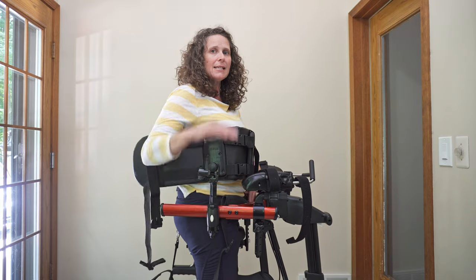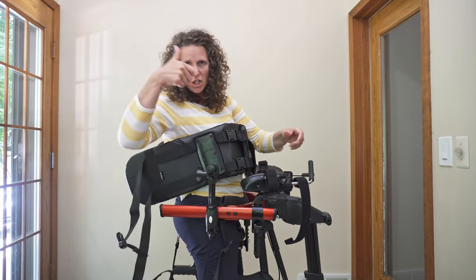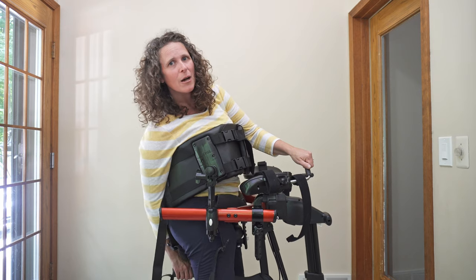Right now my seat is flat, but you can also push the button that is kind of flush with the handle, and that will change your tilt. It's a little bit tricky when you're in it yourself, so I'm going to drop mine back.